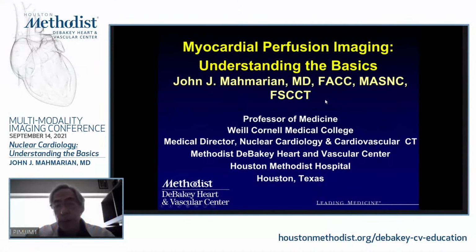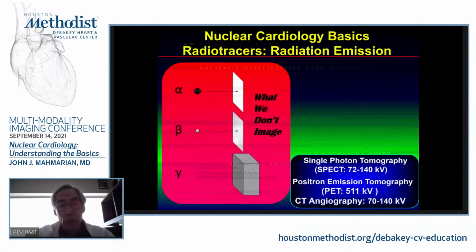Today, we're going to talk about an important topic, especially for those who are doing nuclear cardiology, with regard to how to image patients with specifically SPECT and also PET imaging, and what are the fundamentals that allow us to do it properly. So let's first start off with what exactly we image.